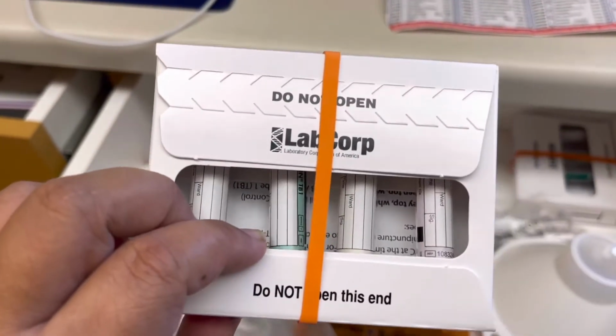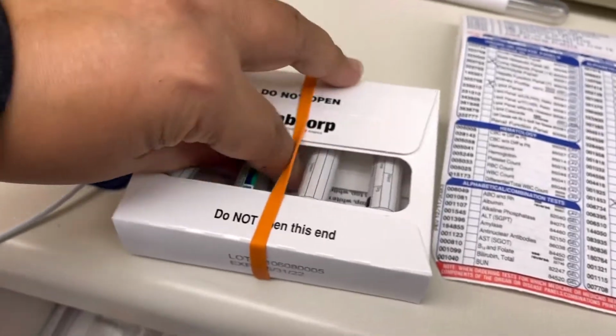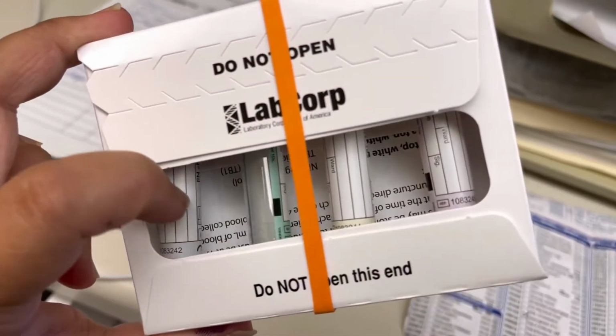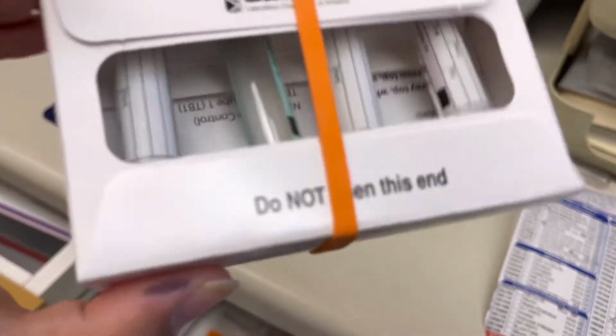There's 4 tubes in there, and I don't work for Labcorp, but that's a very big lab and they're all over the world. In each tube you have to put around 1 milliliter of blood in there. If you guys have any other questions about this kit, just shoot me a message and I'll try my best to get to you.